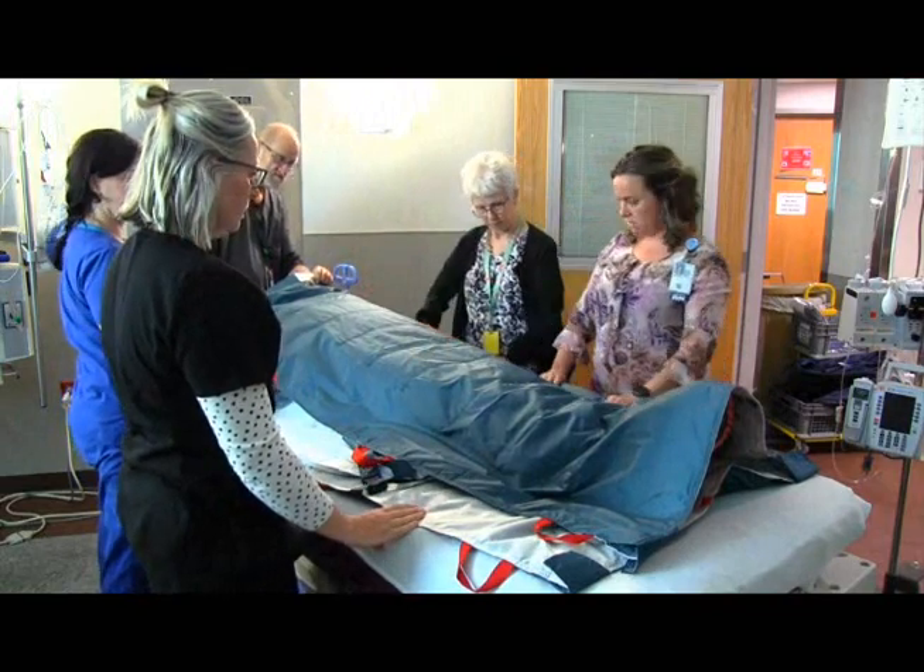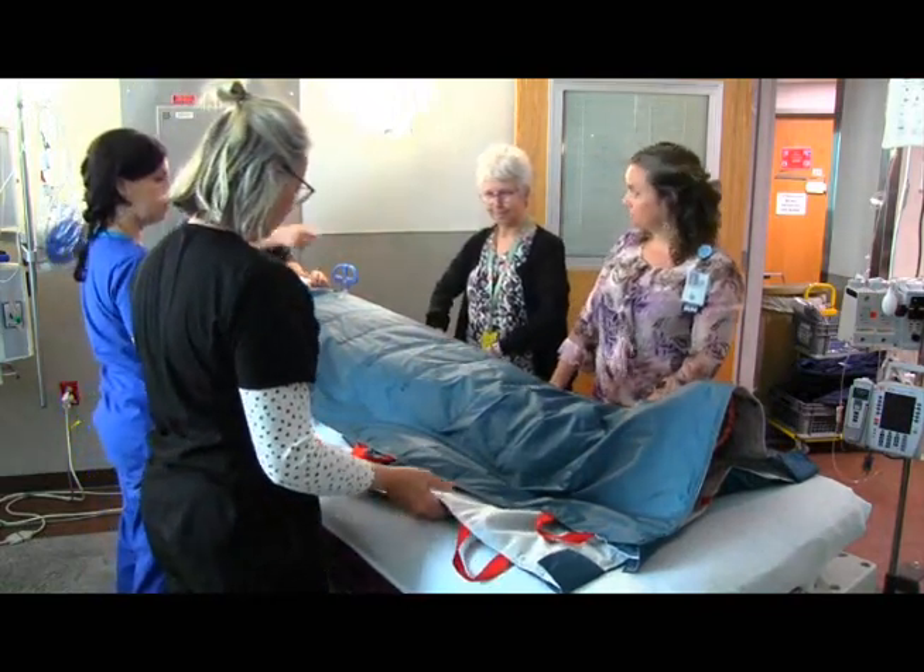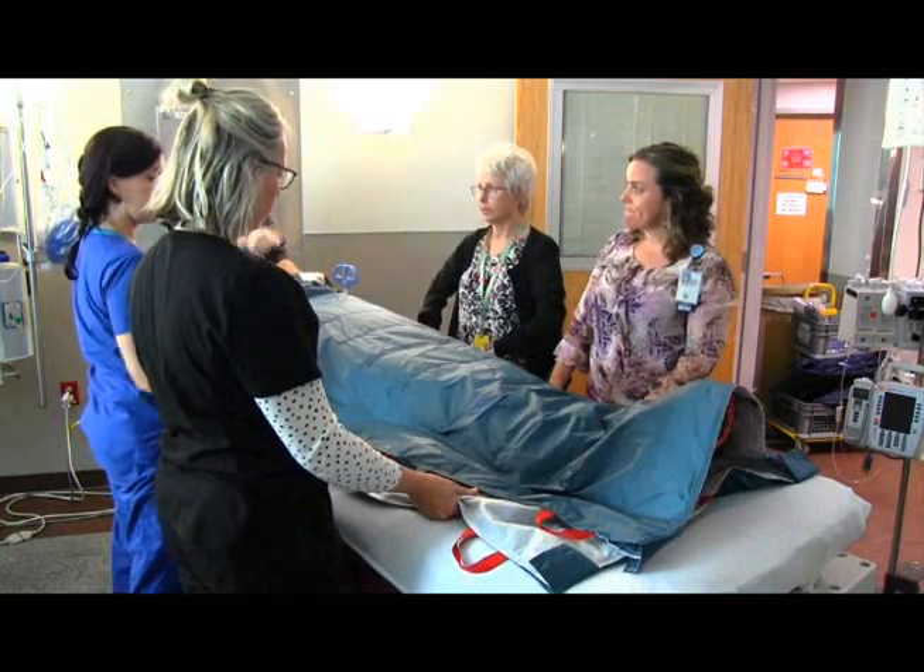Cinders will grasp the bottom mat only with palms up. Receivers will grasp both mats, pushing down and forward.